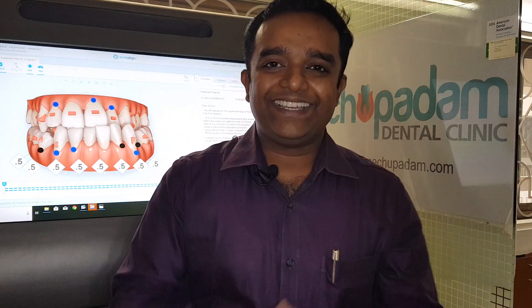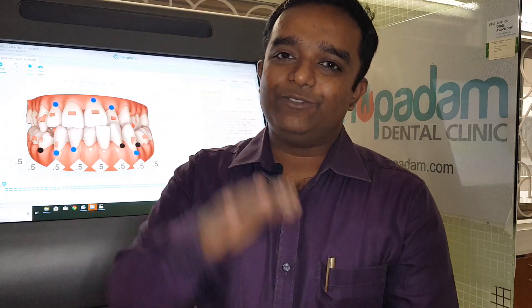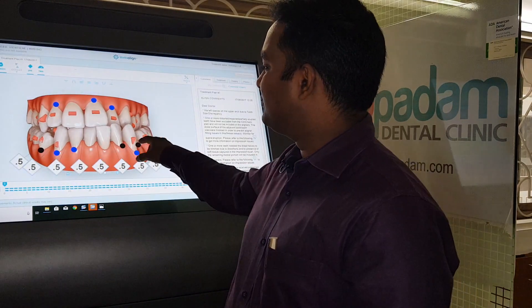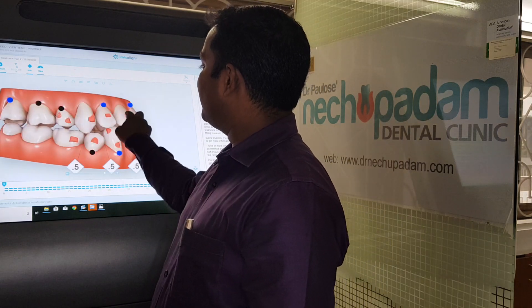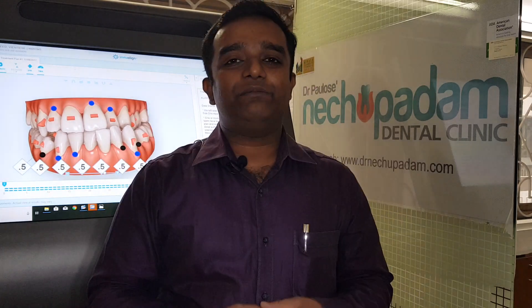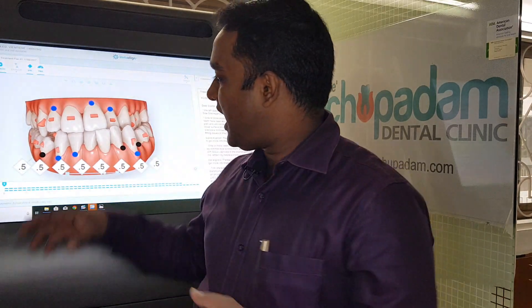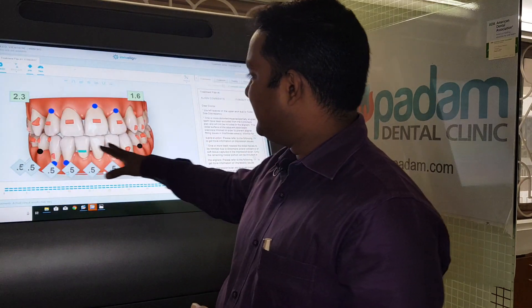When we see a patient, the orthodontist analyzes the patient and forms a treatment plan. Then we take an impression and convert it into a 3D model, as you can see here. After that, we plan how the final result should look, and the orthodontist positions the teeth in the correct final positions.